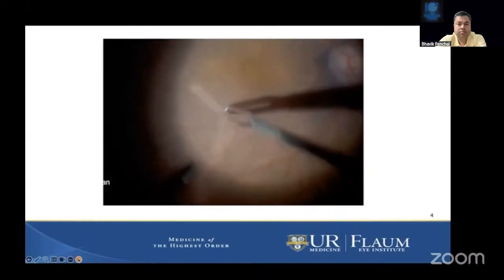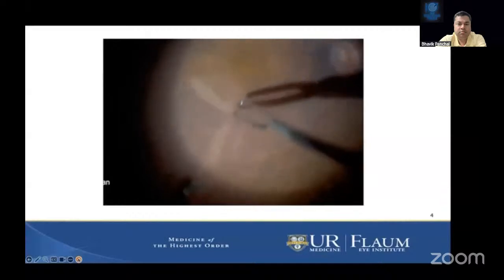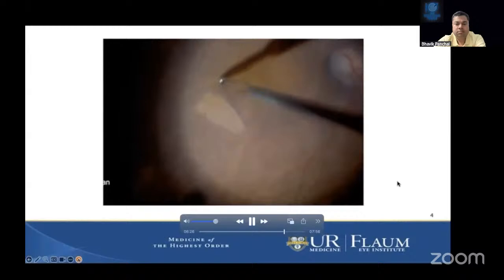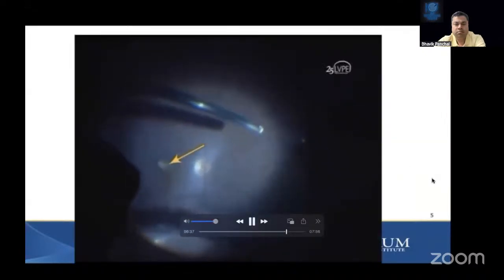But again, this video was showing the nice stain, the high magnification, and also the 3 steps: break, extend the break, and then fold the ILM. The next slide. And this video shows the wide angle lens for vitrectomy PVD induction.